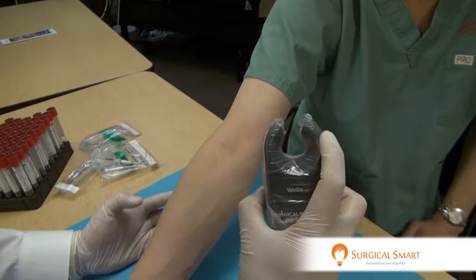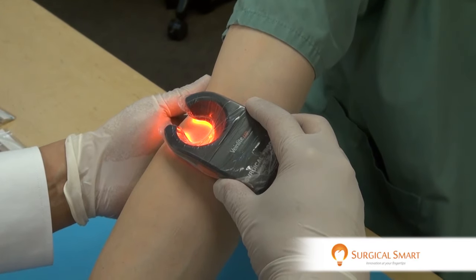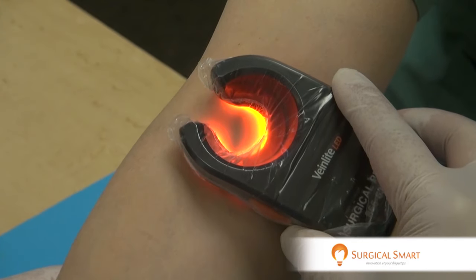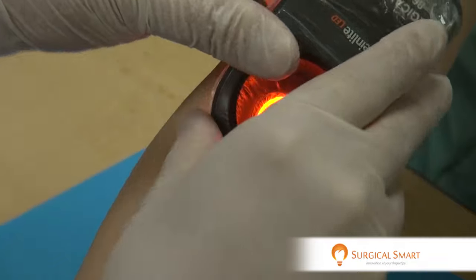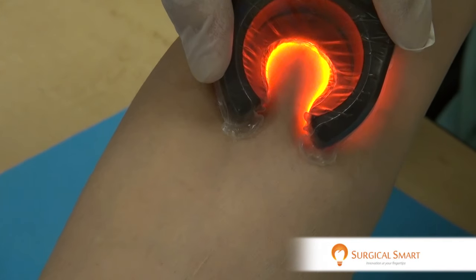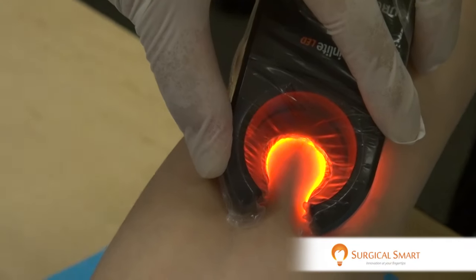Now, I just want to demonstrate that when you use this, you want to turn on the VeinLight and run it sideways laterally, drawing it from the lateral all the way to the medial. What you're doing is looking for a vein that is intersecting the actual length of the arm, and you can trace out that vein with the VeinLight. Once you have the vein localized, you can rotate the VeinLight 90 degrees, which allows you to see the VeinLight path on the arm. The beautiful thing about this unit is that it's designed to apply traction onto the skin so that you can perform your venipuncture just as is — you don't have to modify your hand or finger position.